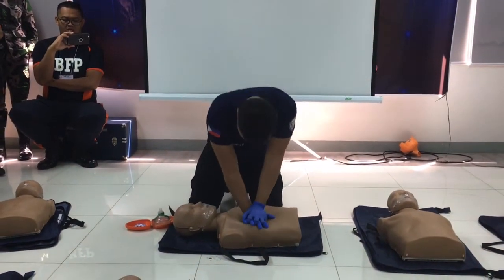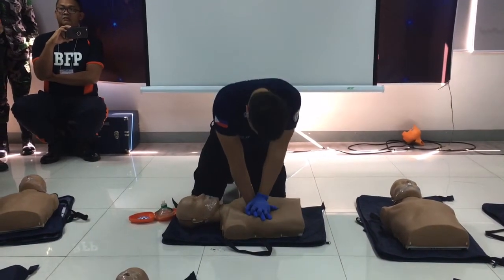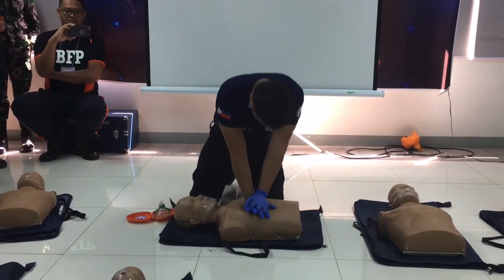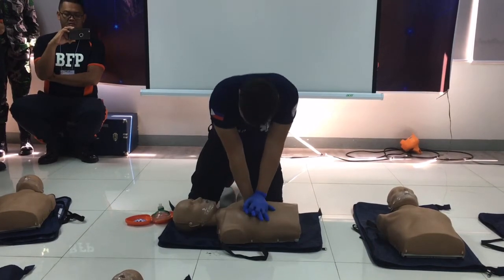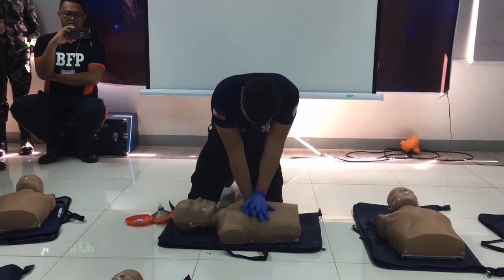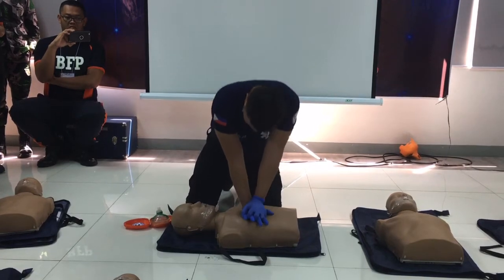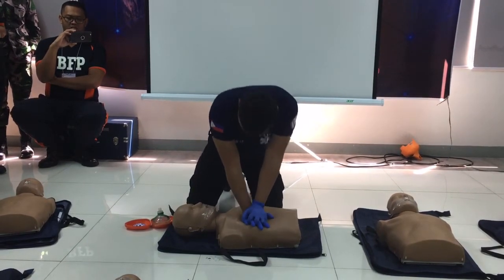1, 2, 3, 4, 5, 6, 7, 8, 9, 10, 11, 12, 13, 14, 15, 16, 17, 18, 19, 20. 1, 2, 3, 4, 5, 6, 7, 8, 9, 4.